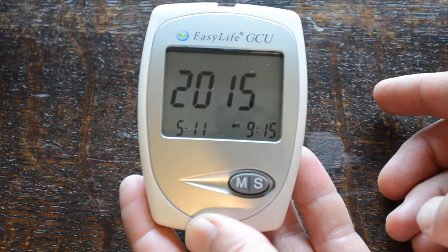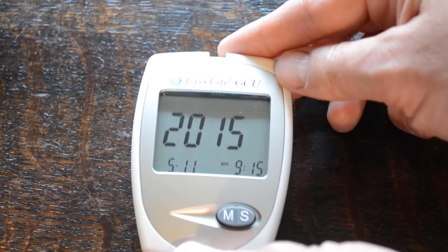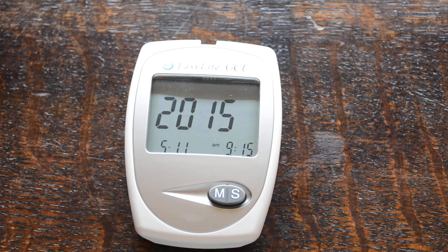By pressing the M button again it just flashes 2015. You just leave that and it will time out after 30 seconds and store that date, time, and year.